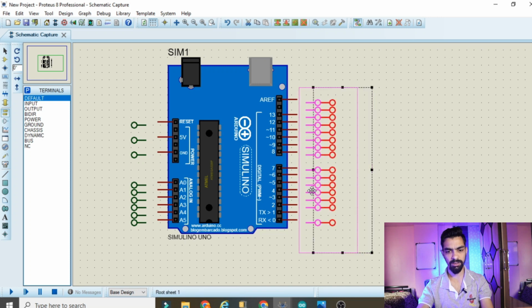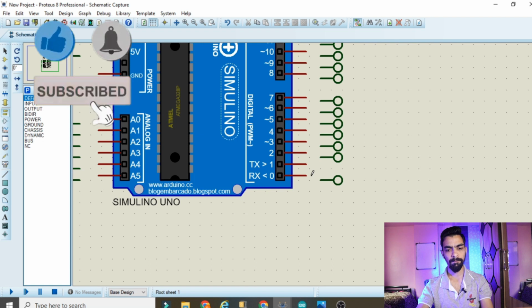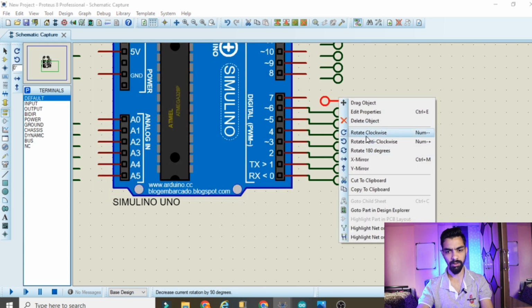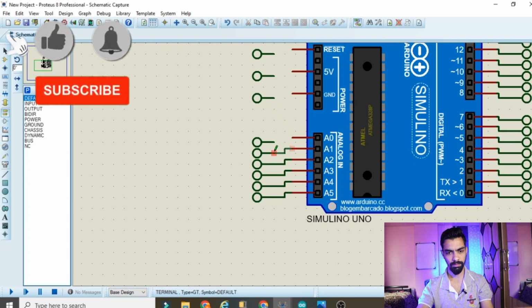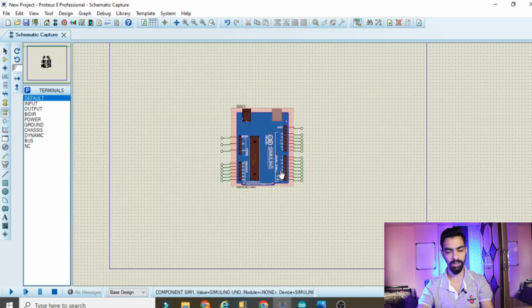Then select all of them again and shift them near to the Arduino. There should be a one block gap between the two pins. You should not place the pin like this. You should place it like this only. One block gap should be there. Then you can connect the pins one by one like this. One default pin here, rotate 180 degrees, then connect like this. Then these pins also you can connect one by one. Up till now we have connected all the default pins to the Arduino.